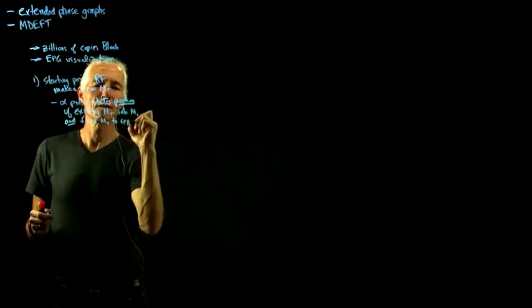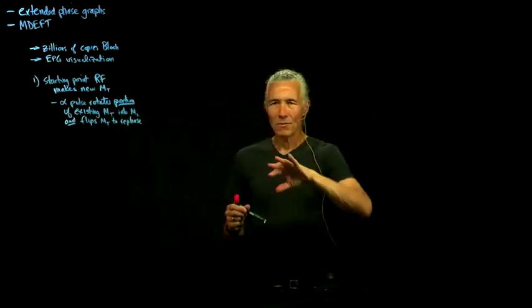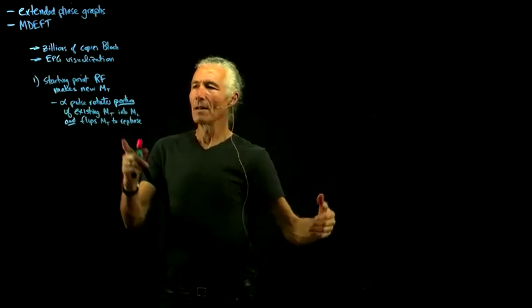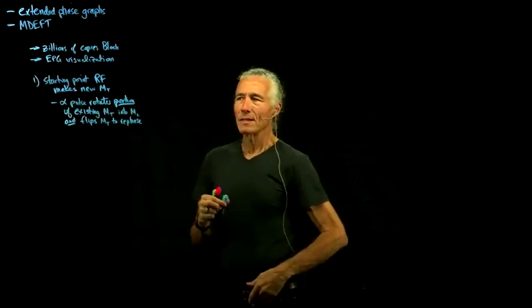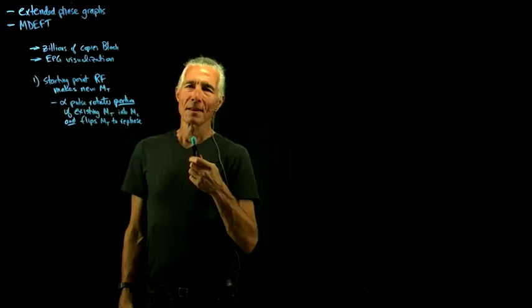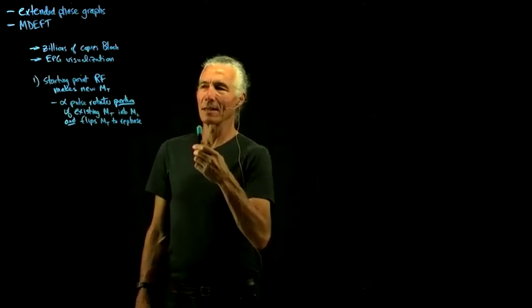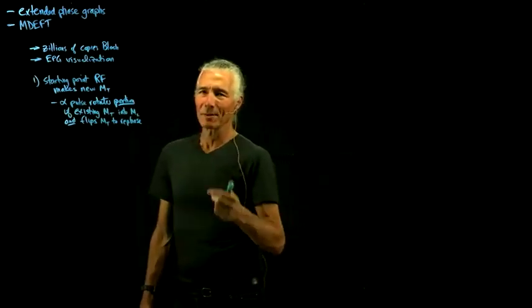So there's two things going on. So you flip some of the spins, and the ones that were ahead get behind, and then after the same amount of time you'll get an echo. But at the same time, it also saves some of the transverse magnetization in the longitudinal, and the longitudinal is not subject to the dephasing because it's in the z direction. And so you can save some of the transverse in the longitudinal.